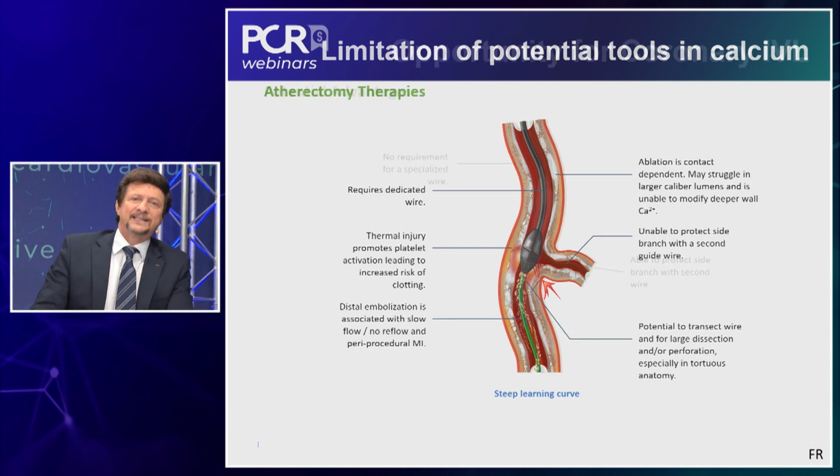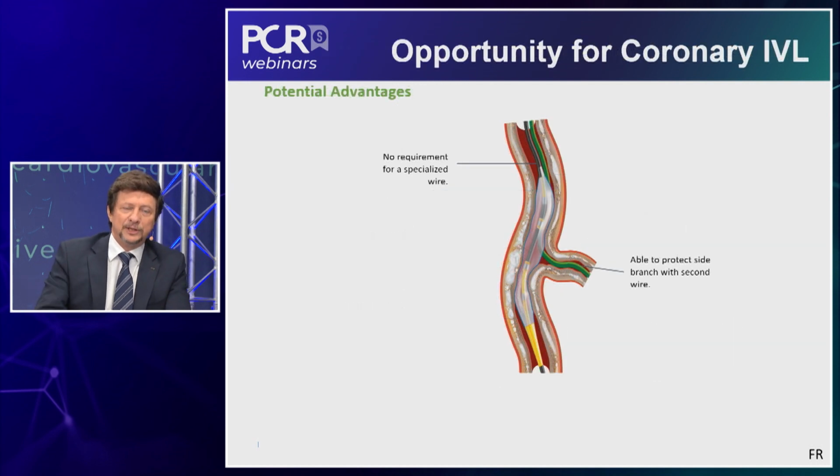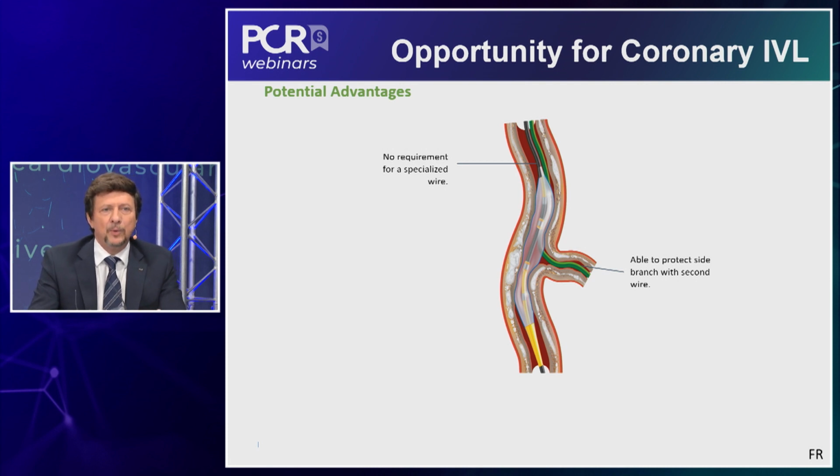If we go instead to the option that we selected for this case, which is a balloon-based technology, we see that we have the wire in place. This wire is okay. You can leave your side wire, the one we put on the first diagonal, and you just push a balloon. This balloon, as Javier said, is not low profile, but we have created already an adequate lumen to navigate, and you saw how easily it went.